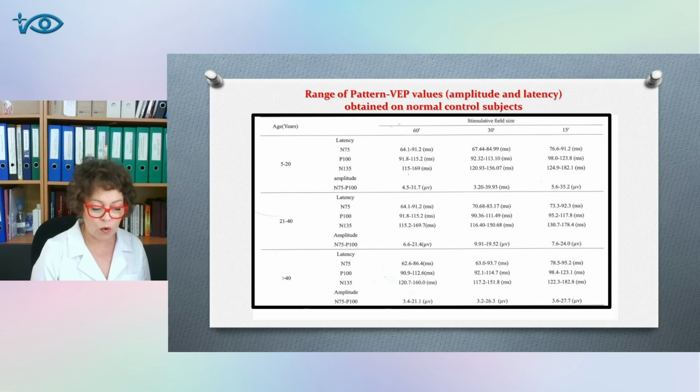The W-like form of the P100 component is evoked by an increase of the participation of perimacular structures in its formation and may indicate the partial atrophy of optic nerve, central scotomas, and focal lesions along the visual pathways. The asymmetry of the P100 latency index of more than 10 milliseconds is observed in the case of circulatory disorders in the vertebrobasilar basin. There are several distinguishing features of VEP analysis between children and adults.